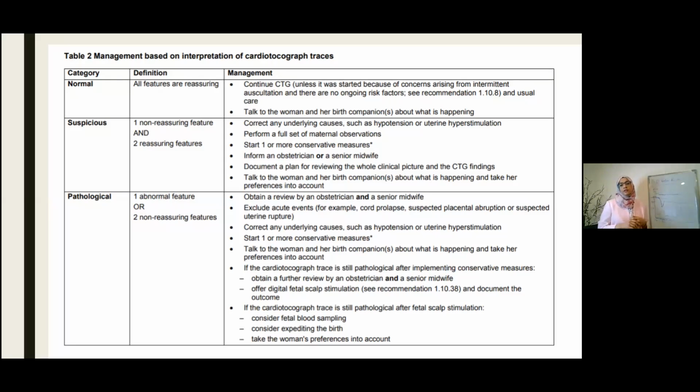The posh new ones have got alarms for the heart rate of the mother and for decelerations. And now that you ask, I will tell you the best alarm that we have. Sometimes when we have got a pulse oximeter on the mother's pulse, in the good CTG machines, you will get 3 things. You get the contraction, you'll get the CTG of the baby, and you will see there is a thin line, and that is the maternal pulse. So when sometimes you are not monitoring the baby correctly, you will see that the fetal heart rate merges with the mother's pulse, and that's what makes the machine go crazy, because the machine cannot have 2 lines mixing.